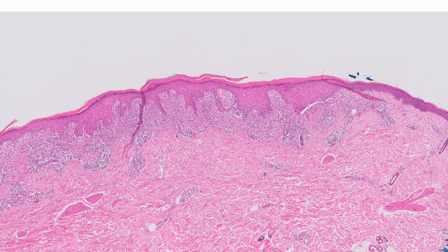This pattern is seen across the entire lesion and is very typical of lichenoid keratosis. Really it is a diagnosis of exclusion — the important thing being to rule out any other particular lesion associated with a lichenoid inflammatory reaction. A variety of epidermal and melanocytic lesions will often show a lichenoid reaction, and we only use the term lichenoid keratosis when there is no other obvious diagnosis — just an area of acanthotic, hyperkeratotic epidermis with an associated lichenoid reaction.